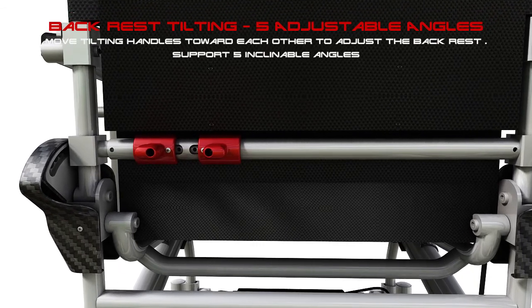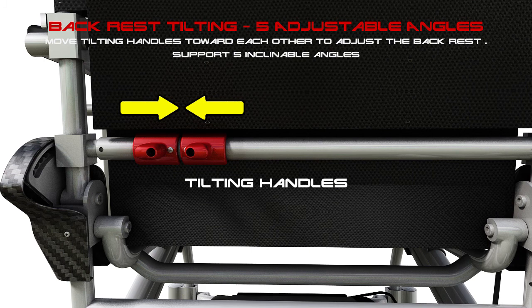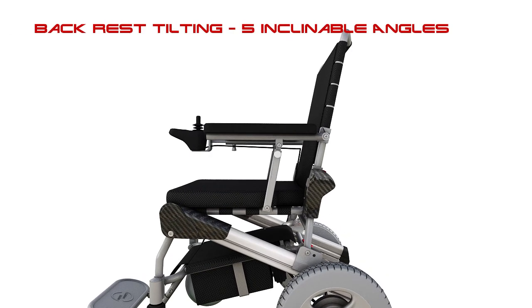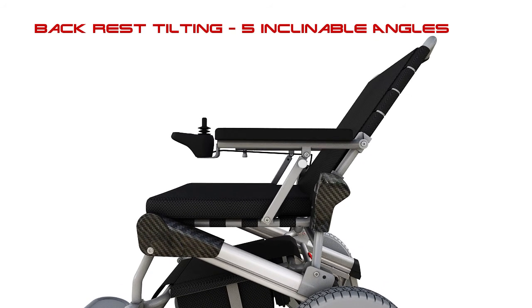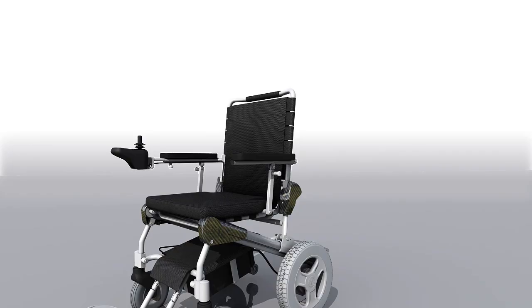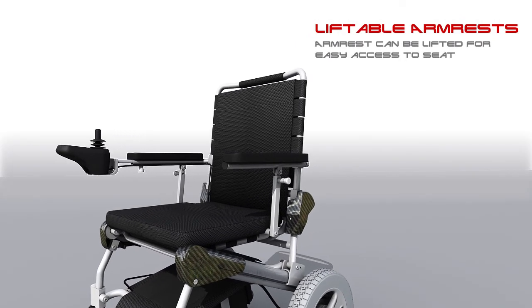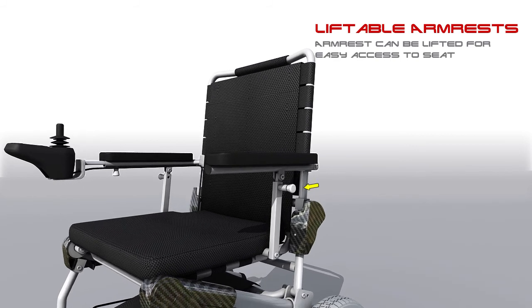Backrest tilting: 5 adjustable angles. Move the tilting handles toward each other to adjust the backrest, which supports 5 inclinable angles. The liftable armrest can be lifted for easy access to the seat.